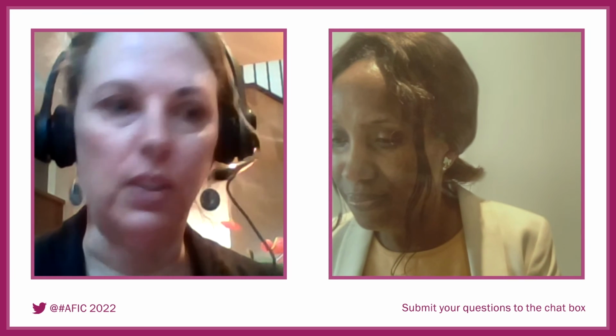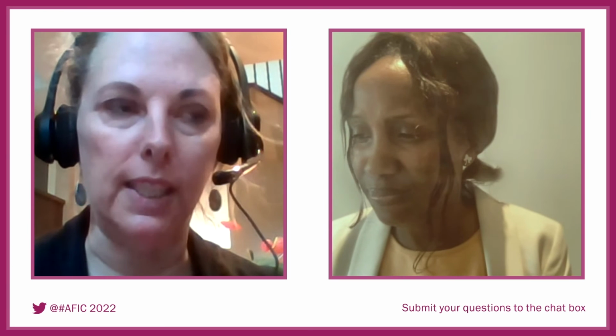Why did we no longer call it A and B? This is based on ISUOG, so the international group as well, that had a statement to say to use a numerical value instead. And I'm not exactly sure of the specific logic of it, and if anybody does, feel free to put it in the chat. But basically, it's just, again, back to the idea that we want standardization so that we all speak the same language when it comes to obstetrical ultrasound.